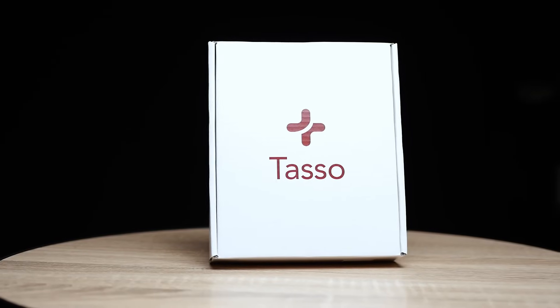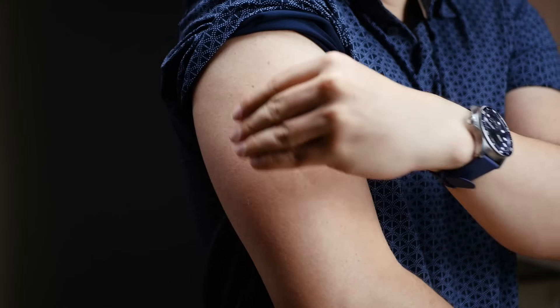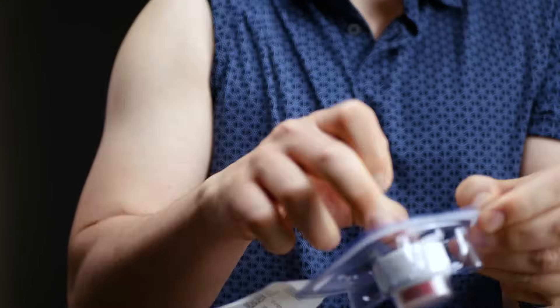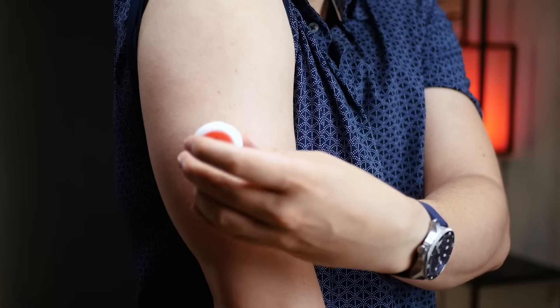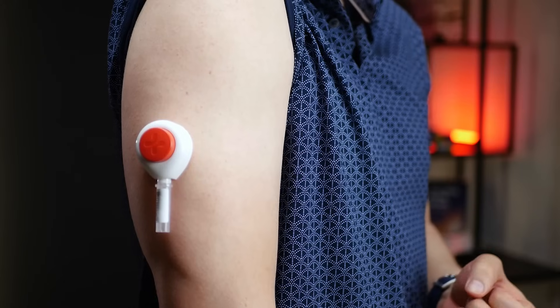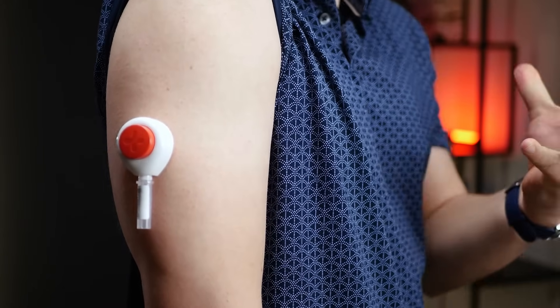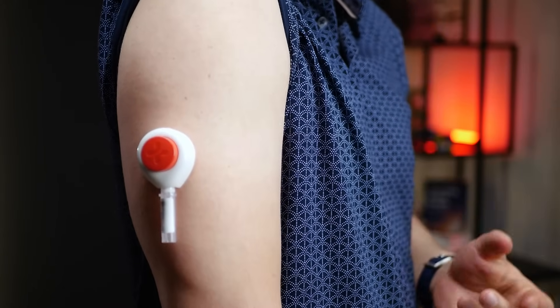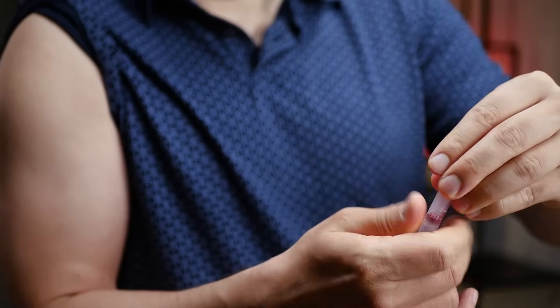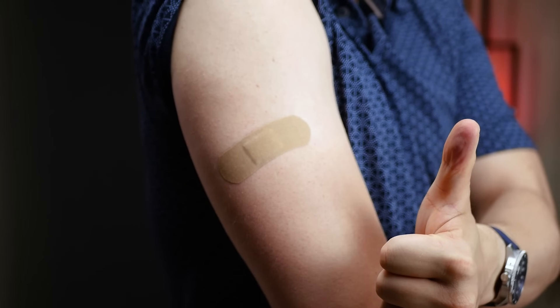First up, let's look at TASO. We have to clean the application area on our upper arm. TASO's device then adheres to your upper arm — we peel off the adhesive backing, attach the device, and press the activation button. Once activated, it uses a gentle vacuum to collect a blood sample without the need for needles. We wait for the collection to complete, indicated by the fill line.